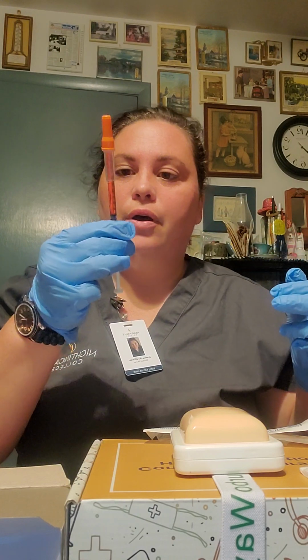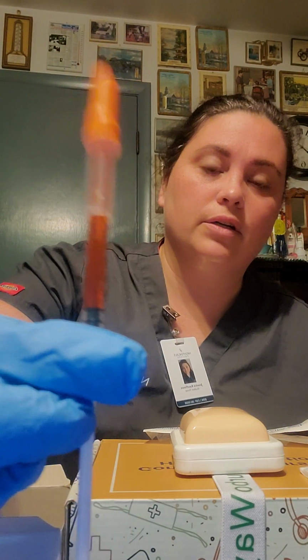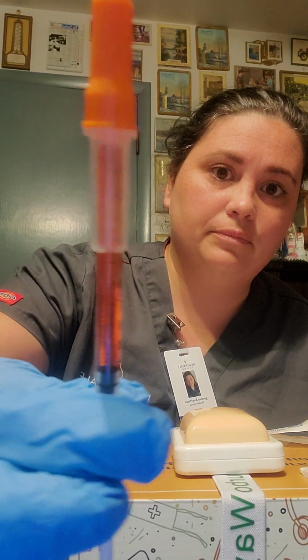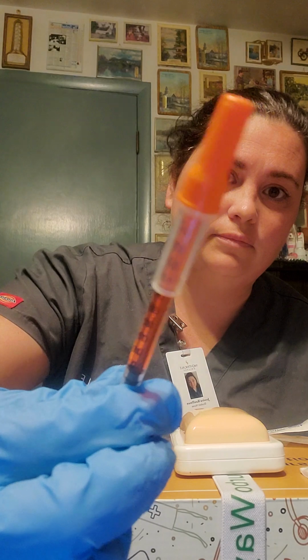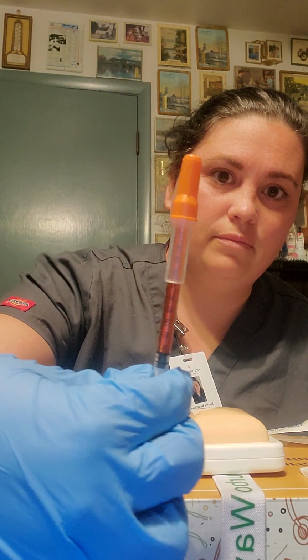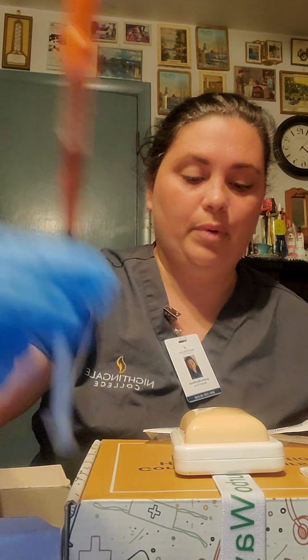Alright, so I will show you here. It's 1 ml. I don't know if that angle's any better. This phone's kind of terrible to pick up on stuff. Okay, so I'm going to lay that down.